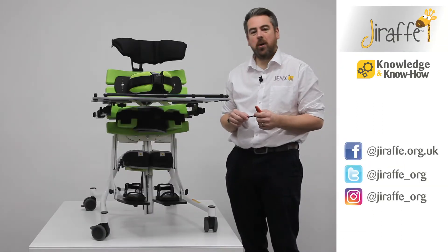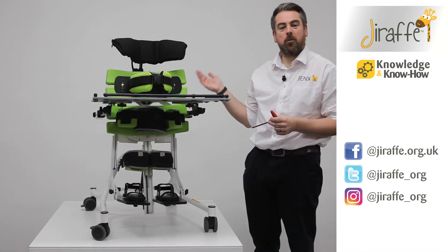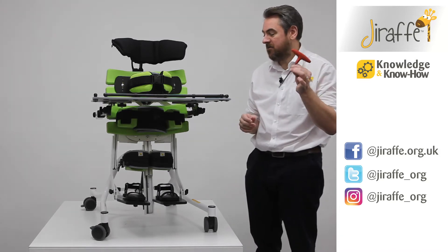In this part of the video we're going to show you how to change the product from the supine configuration through to either a prone or upright position. We're going to use our five millimeter allen key.